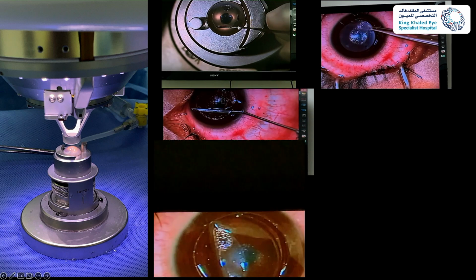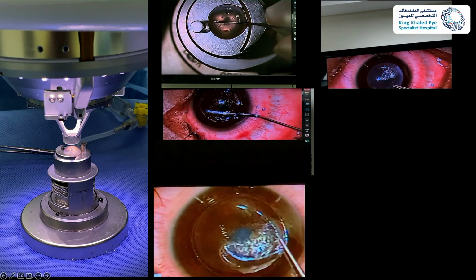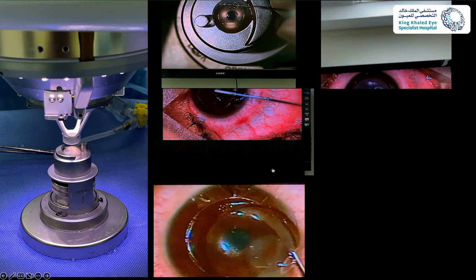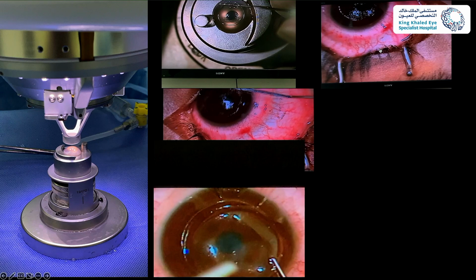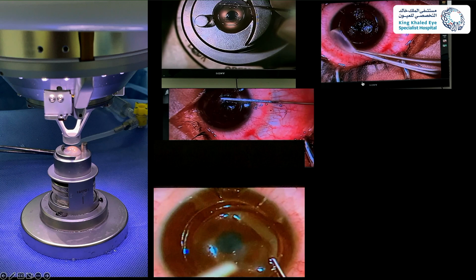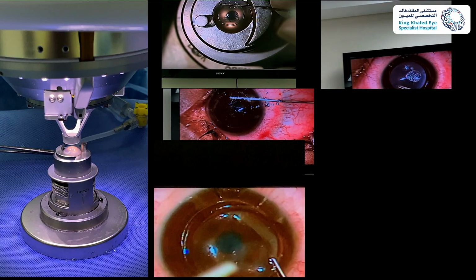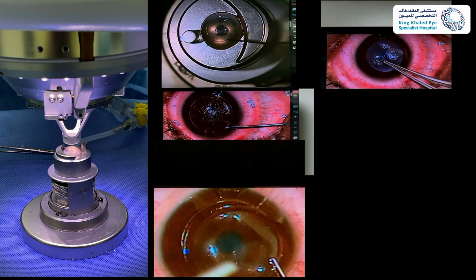Here you can see smooth dissection of the microkeratome into the donor cornea, as well as smooth dissection except at the area of the scar in the recipient. And you can see complete removal of the scar here after some dissection. And here you can see we are applying the anterior cap into the recipient bed with good alignment, and we put stitches. So basically, FALK made the procedure shorter. You don't need to do the two-step modified procedure.